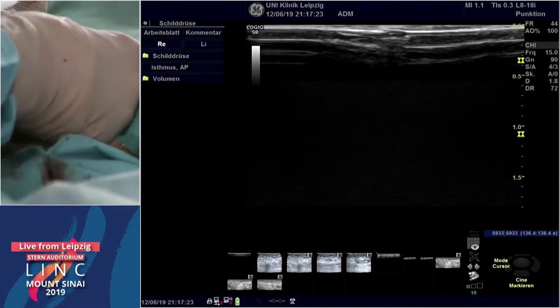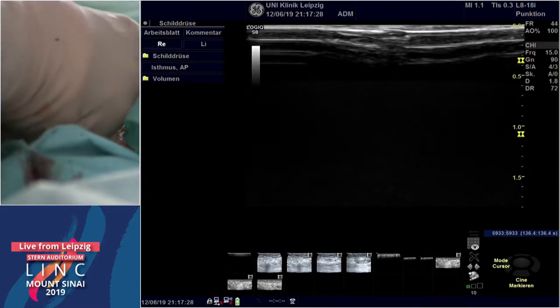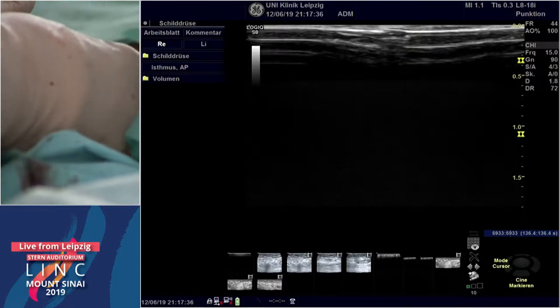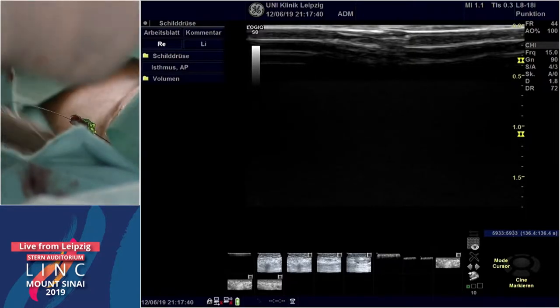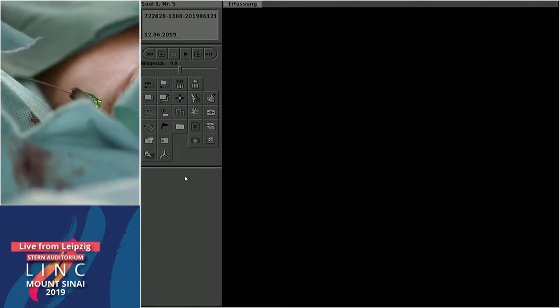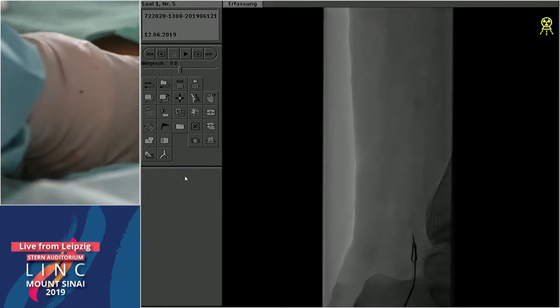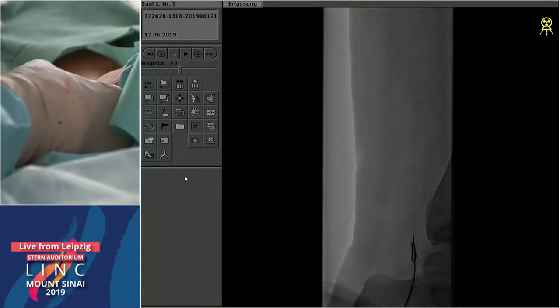A couple of good wires in cases with reconstitution of a posterior tibial artery around the ankle: the Boston Scientific V18 wire, because you can loop it at the distal CTO cap and advance from there. Another option is the Gladius 018 from Asahi — a good wire with a supportive body and soft tip. The Command 018 is also excellent as it won't lose wire memory.